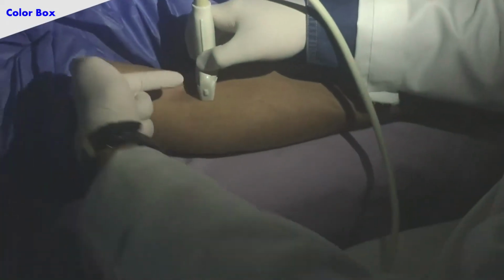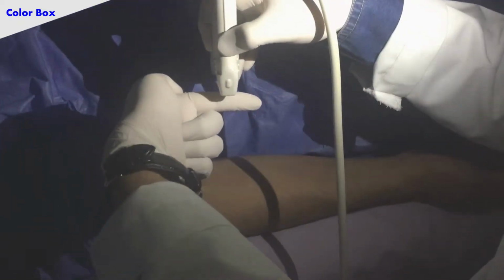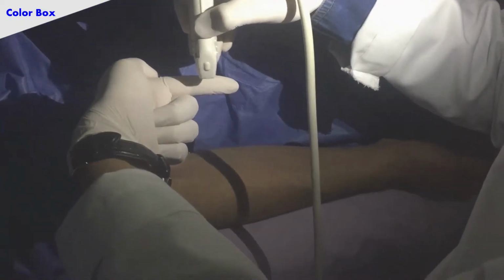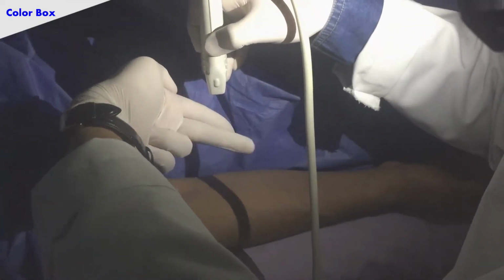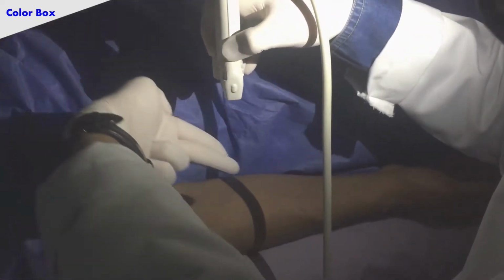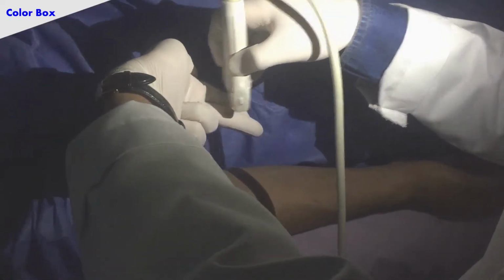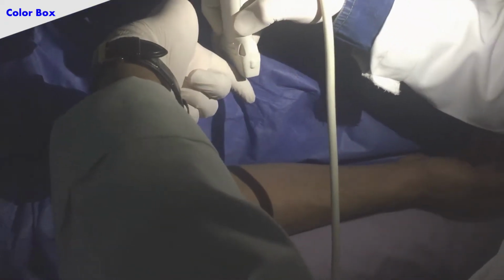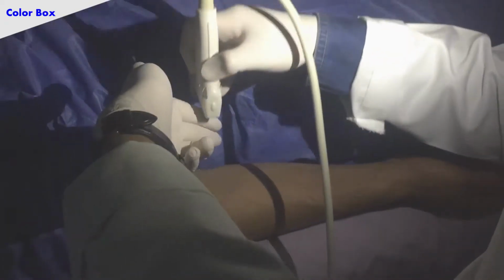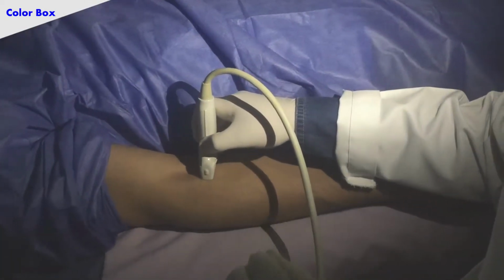Look here, these vessels are running like that, and the probe is like this. Actually, the vessels are like my finger, like this. They are going a little bit deep, so when I put my probe, it makes an angle between this axis and this probe, so this angle makes the color appear here in this region.